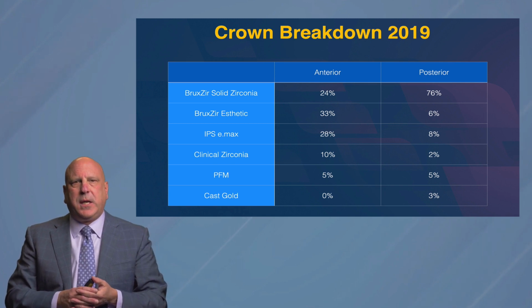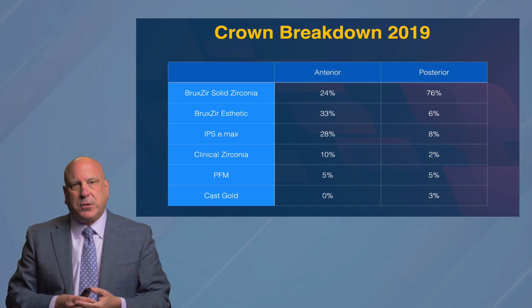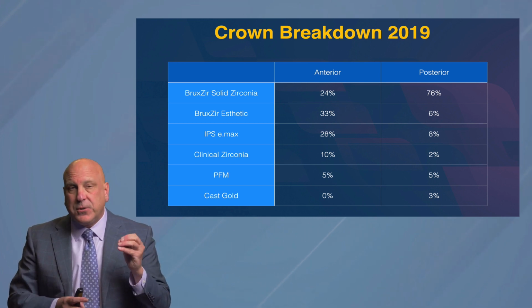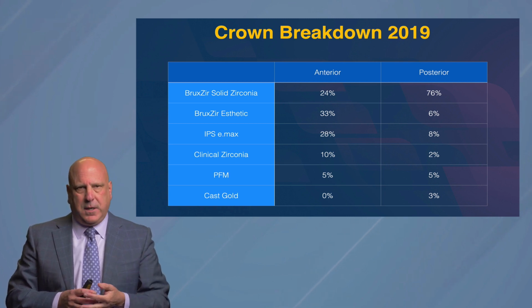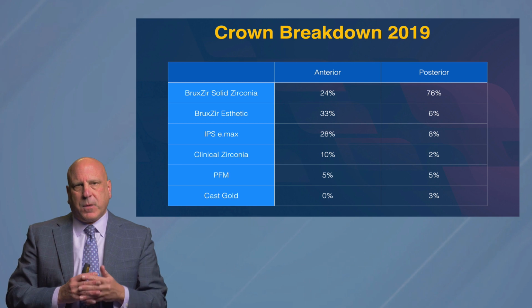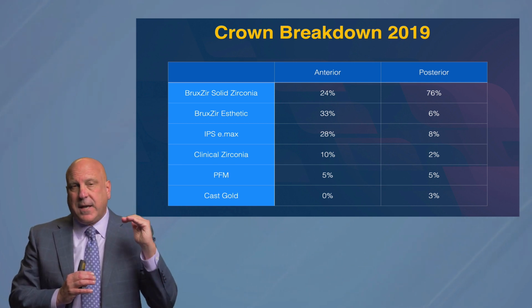When we get to the tooth preparation module, I'll share with you the depth cut base method that I use to make sure that I have enough room. And then you also need to adhesively bond Emax restorations on molars into place, because when you do that, you increase the fracture toughness of the material.